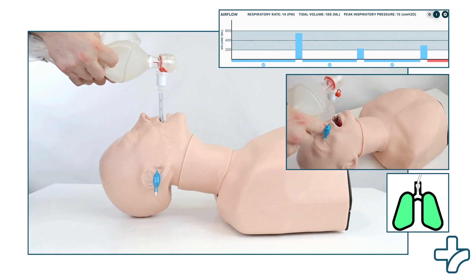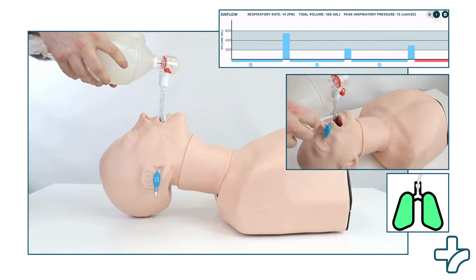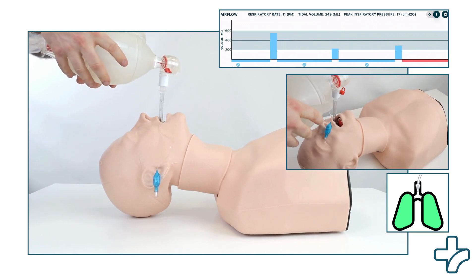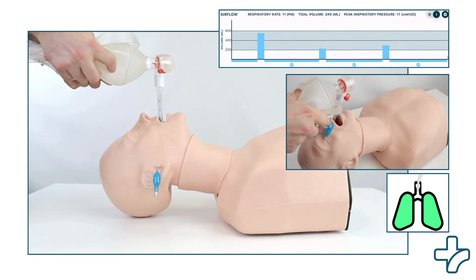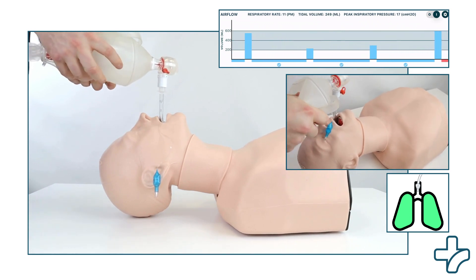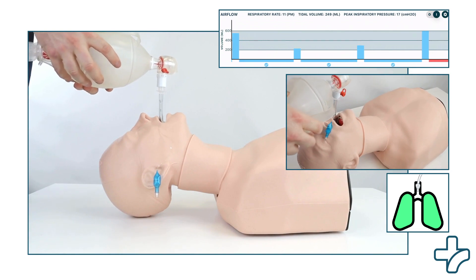Ensure proper placement of the endotracheal tube by observing chest rise and fall with the first few ventilations.